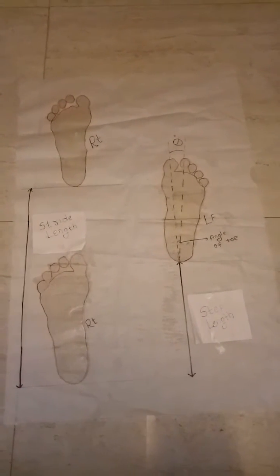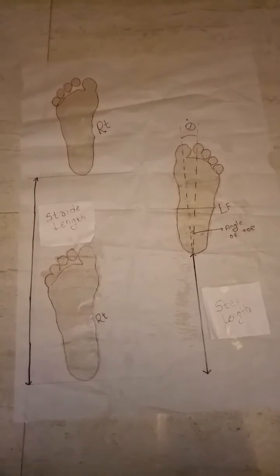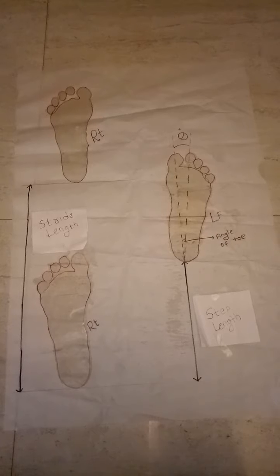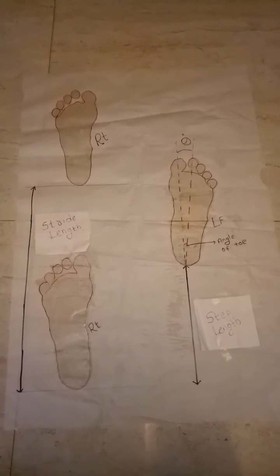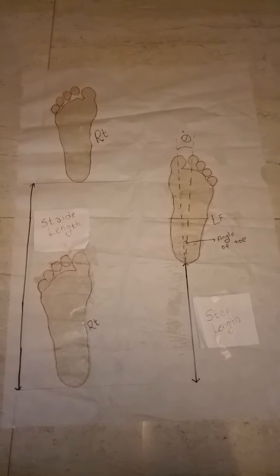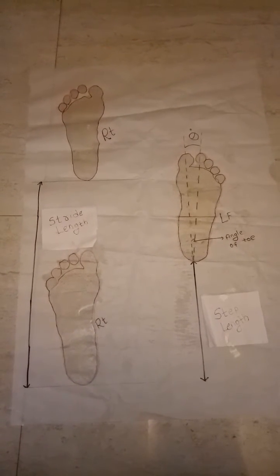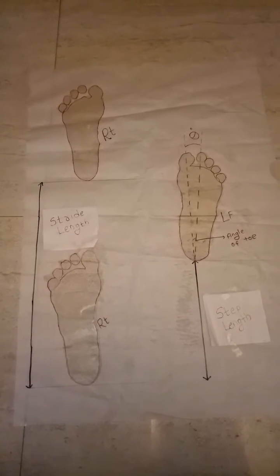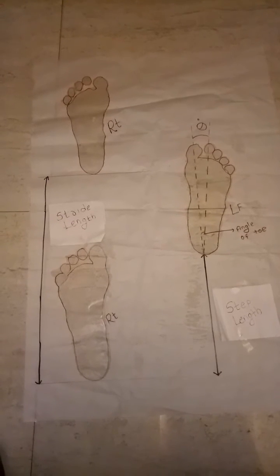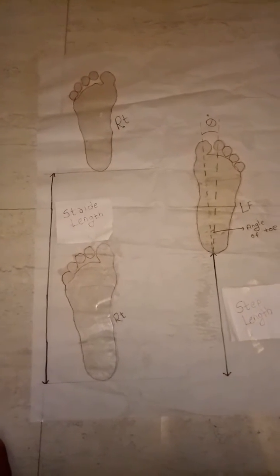Gait is defined as translatory progressive motion of the body segments. In this video we will see how to measure gait parameters. To measure gait parameters we require a dress paper and oil. First we should oil our foot and walk on the dress paper by taking our footprints. Now we will proceed for the measurement.